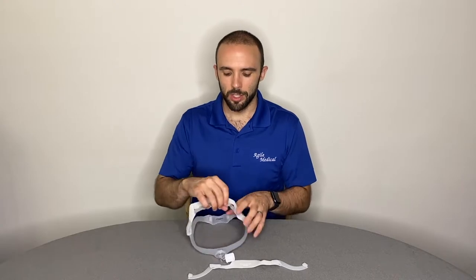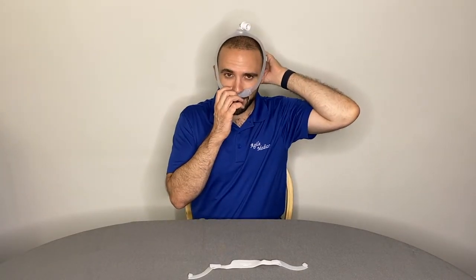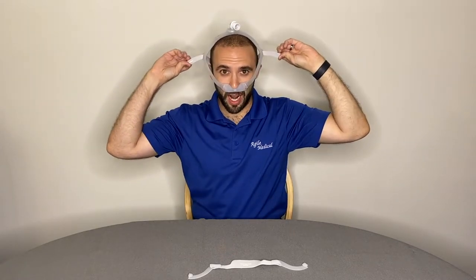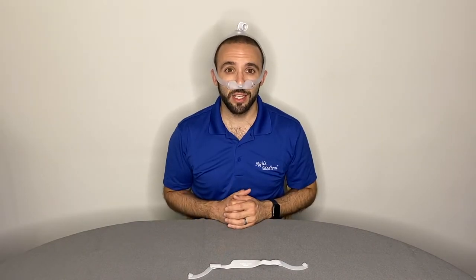When it comes time to put the mask on, hold the nasal cushion in place under your nose and feed the mask over your head. Adjust the straps on either side of your head and secure, but don't secure too tightly. Overtightening can lead to mask leaks and red marks.